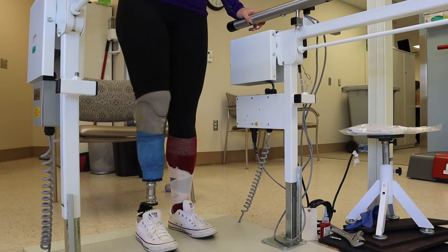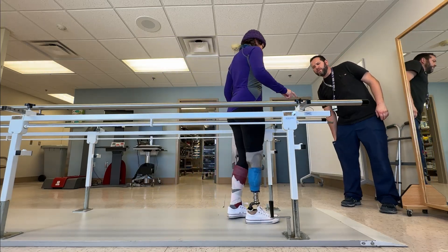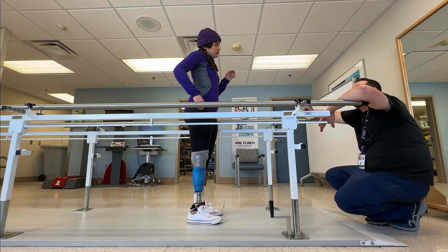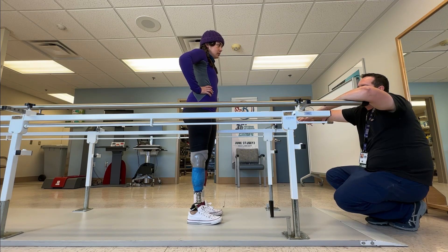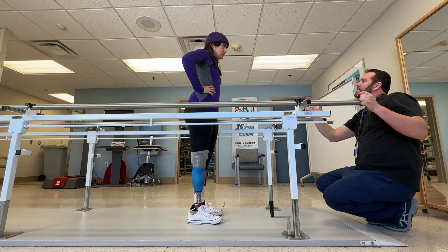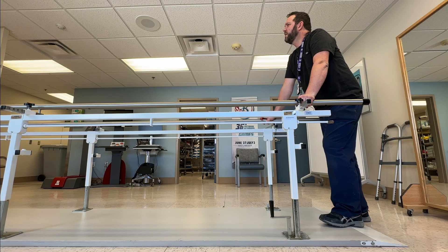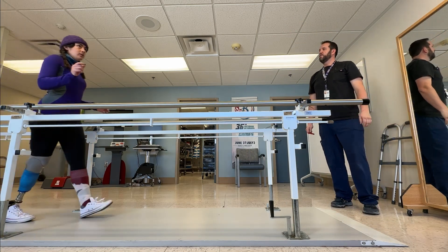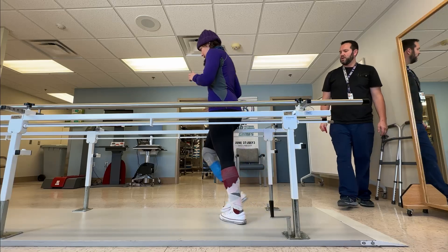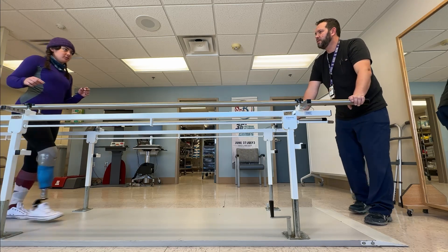I think it's going to switch it up. It's better. It's not kicking to the side. You're kicking out, and you can't really tell if the cap is hitting, but it's looking much better already. It looks better. When we do the next one — well, it depends — we might end up doing another plastic one, but when we go to lamination, we're obviously going to be doing the cosmetics where we're bringing this down to kind of mask the outside of the foot, just like your other one did. How is the spot on the fib head? Are you feeling that at all? It upped it a little bit. You've got to go more with that? I definitely feel it right here. So the trim lines — trim the lines by hand, just a little bit, with the fib head. Look-wise, that's looking good, but how does that feel? It took off a little pressure here, but still good.